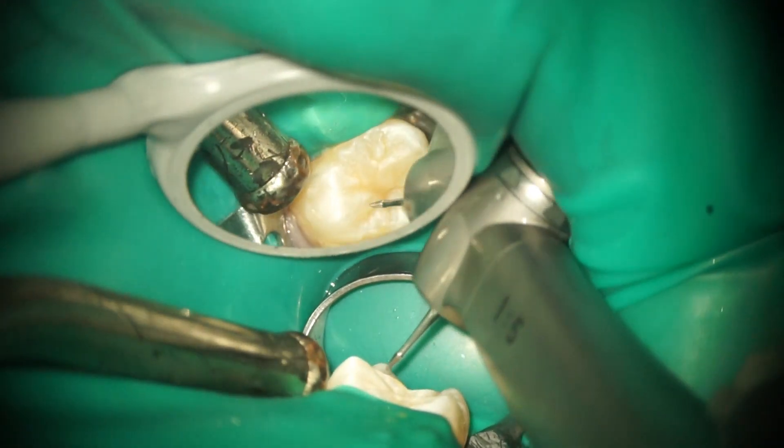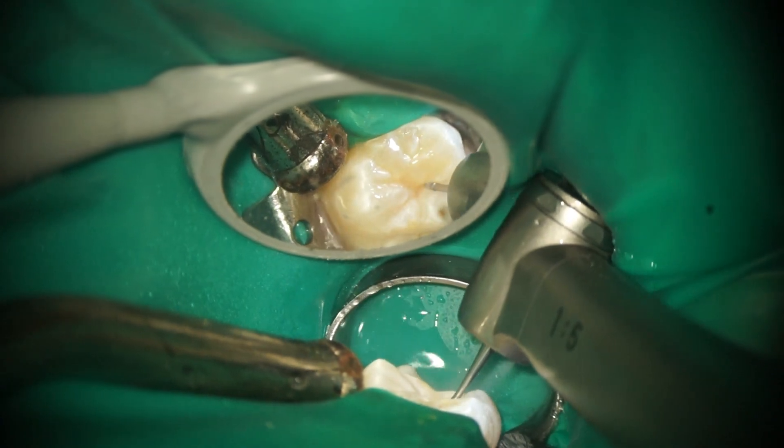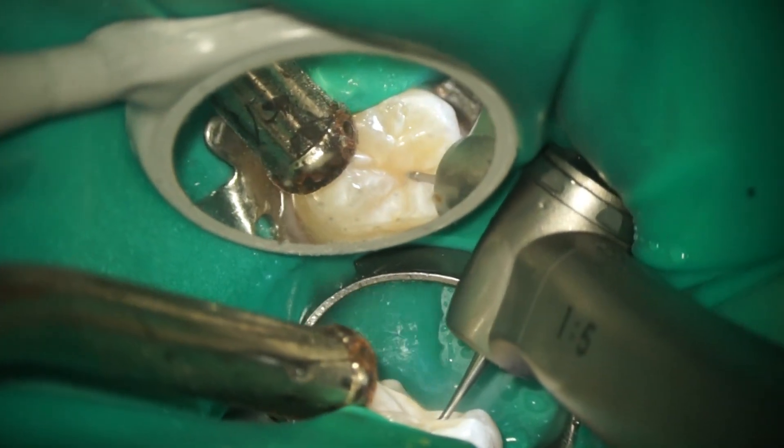This video clip is a case of fissurotomy under magnification. Delicate removal of enamel with a smaller burr achieves the treatment goal.